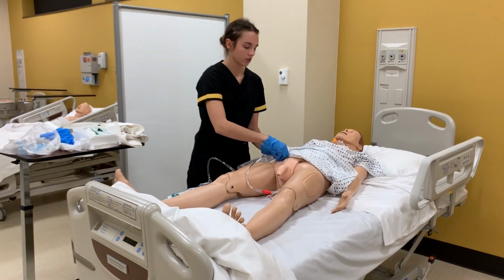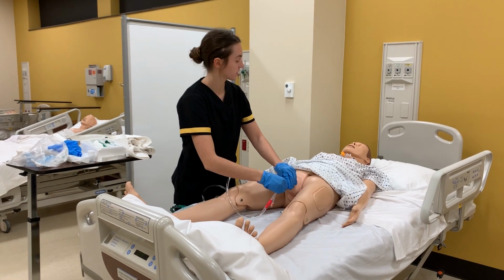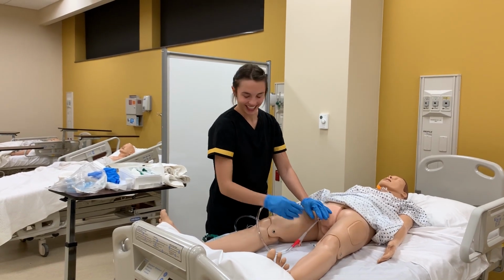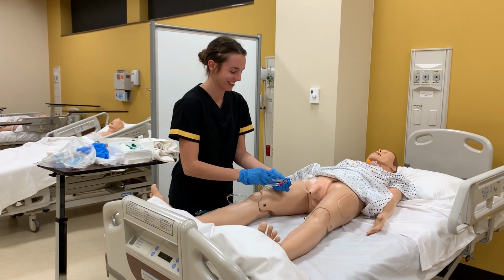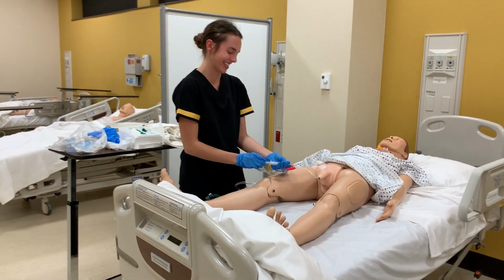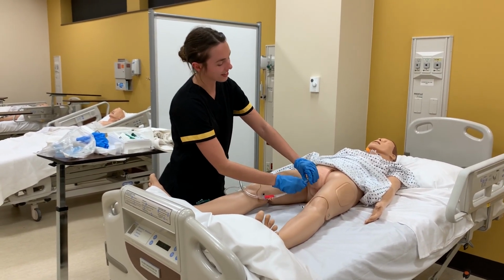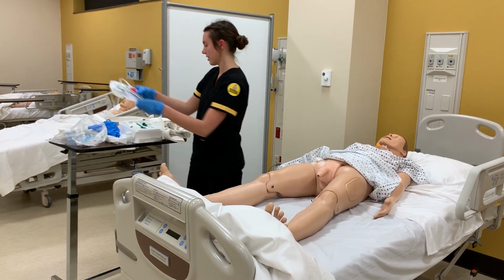Okay, so Mr. Benjamin, we're just going to take it out slowly and gently. So just take a few deep breaths for me. Got a little bit of resistance. I'm sorry. We have to deflate our balloon before we do that. So that would have been very painful for the patient. So sorry. Okay. I take responsibility for that one. So we would now remove it with much ease. There we go. And we are all done with our catheter.